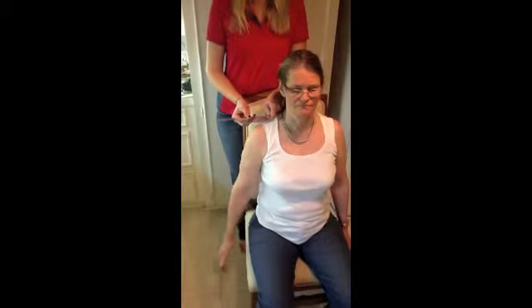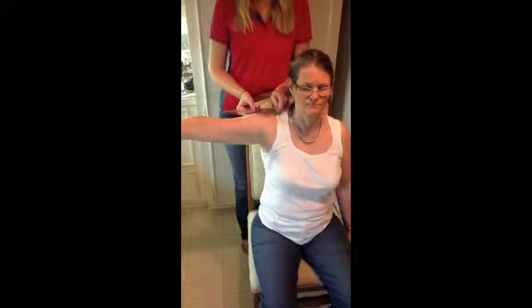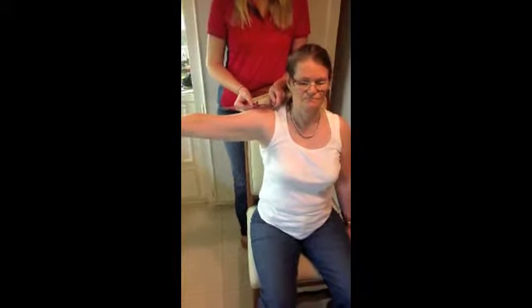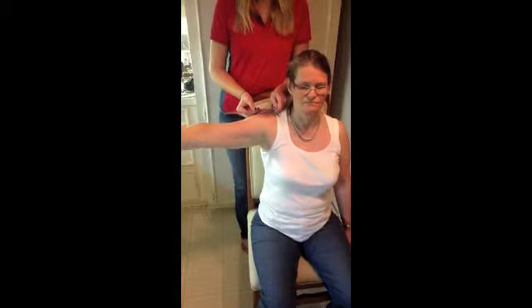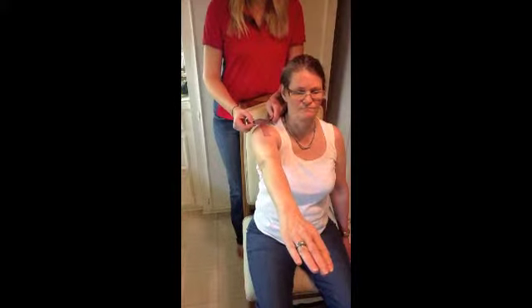For shoulder horizontal adduction, the subject and the goniometer are the same as they were for shoulder horizontal abduction. The client's arm is moved in front of the body in the horizontal plane of movement. The measurement begins at 0 degrees and ranges to 130 degrees.